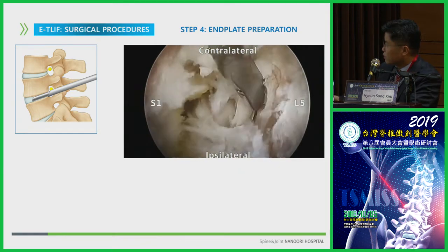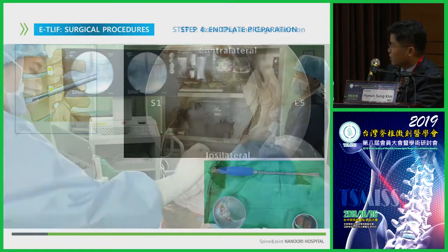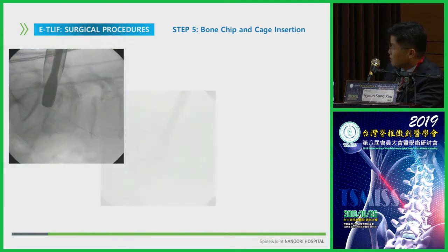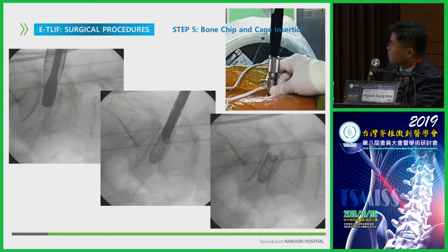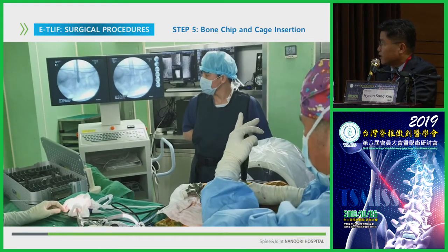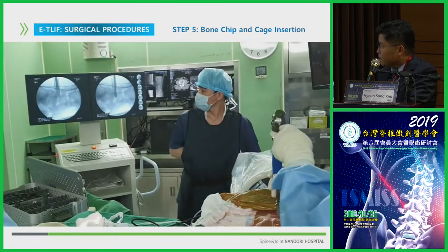You can see here one more decompression. Then we can now insert the bone chip through the same working channel, and then insert the serial dilation and cage. In this process, we change the working channel to a bigger one to insert the cage and then check the height, and firstly insert the cage.